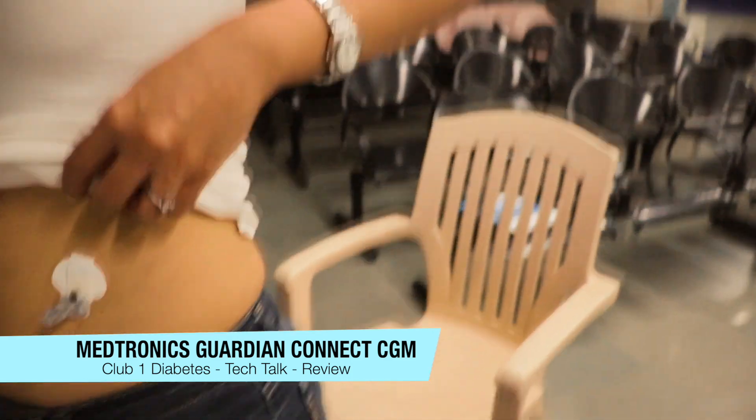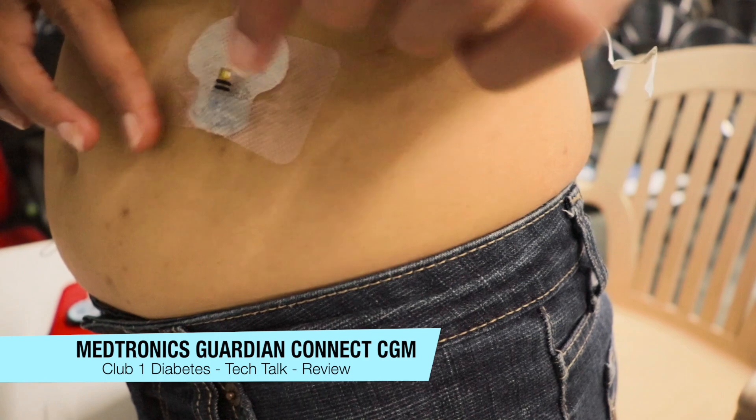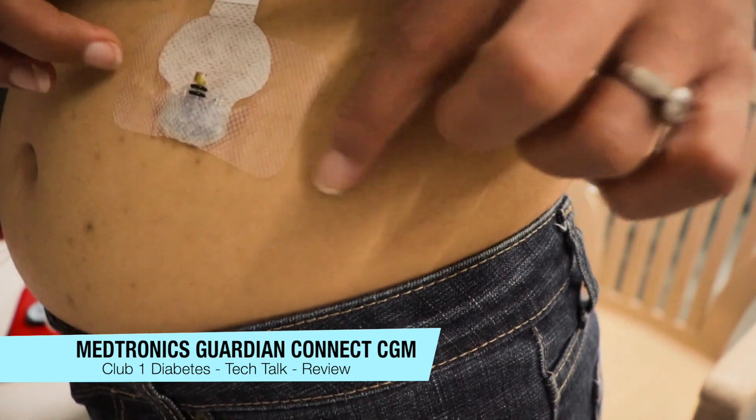The only annoying part though is the false alarms that might confuse you. So it's best to check with a glucometer when you're in doubt.